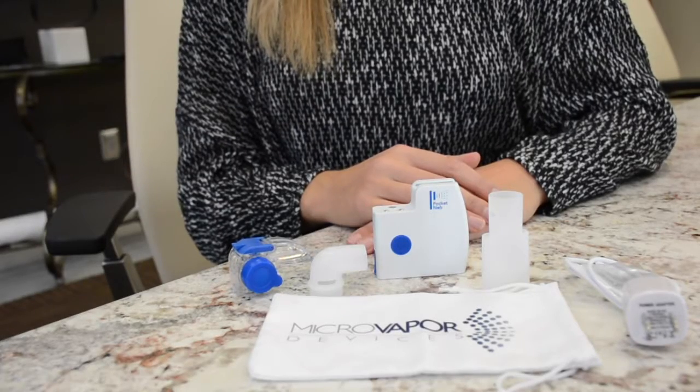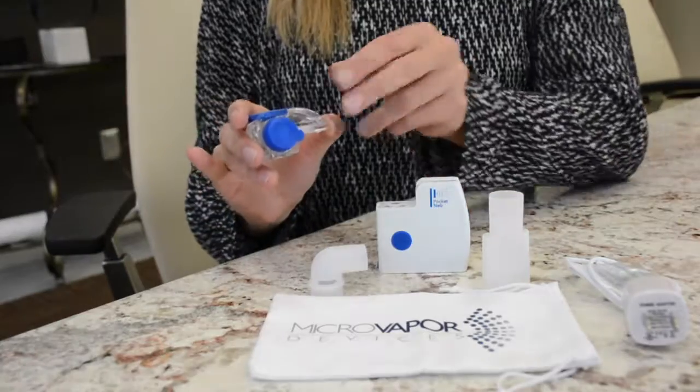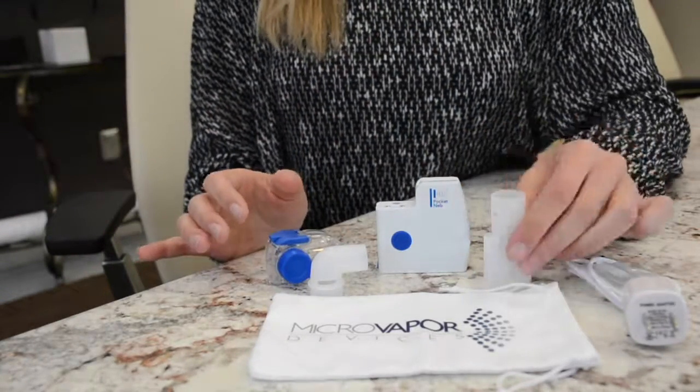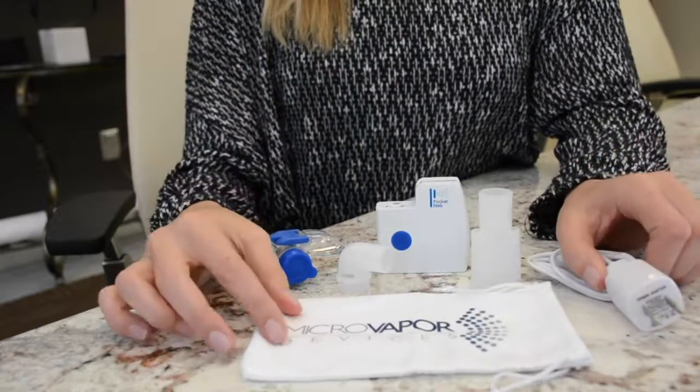The parts that are included in the Pocket Neb: the handset, the medication cup, and the mesh vapor disc cap which is the blue cap right here. A mouthpiece, a mask adapter, a charger, and the travel bag.